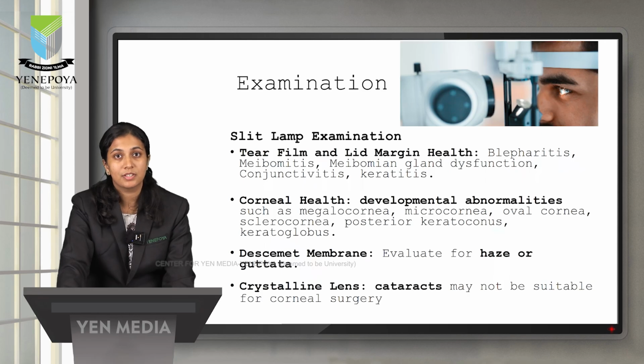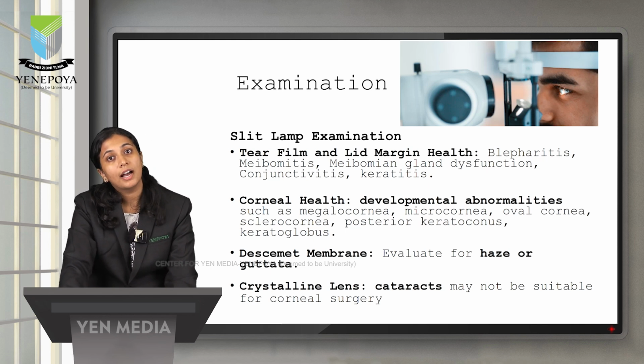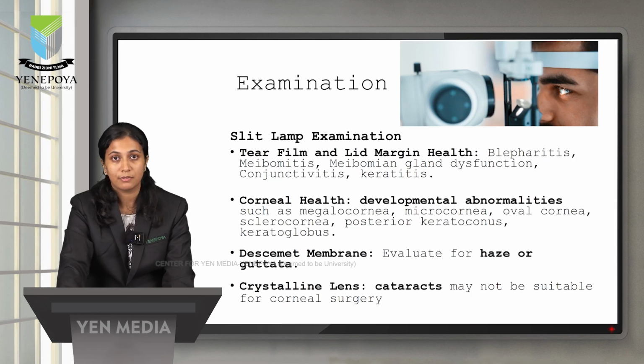Slit lamp examination is required to check for the tear film and lid margin health for blepharitis, meibomitis. In the cornea, health should be checked to look for any developmental abnormalities. Descemet's membrane should be checked for haze or guttae. And patients who have cataract are not ideal patients for refractive surgery, keratorefractive surgery.